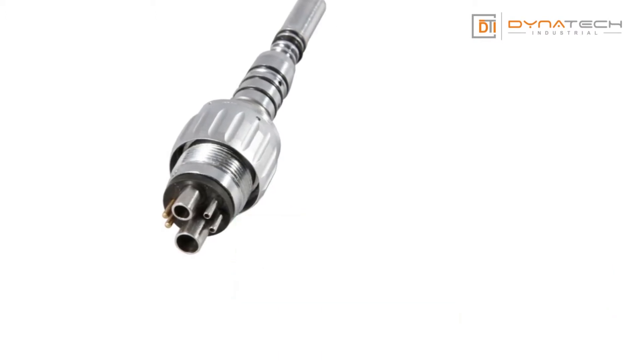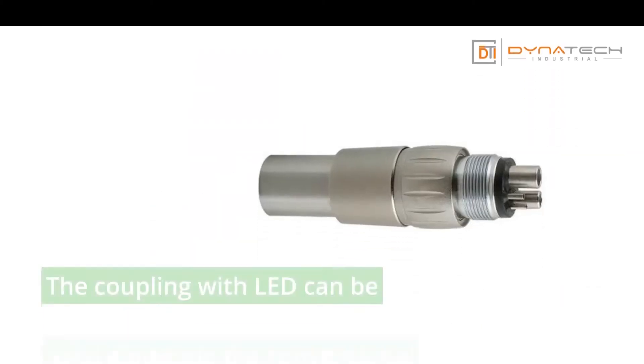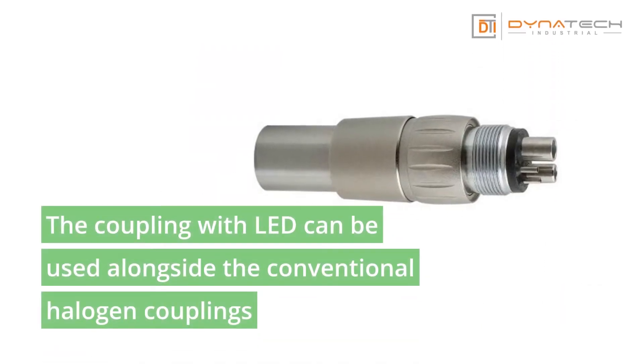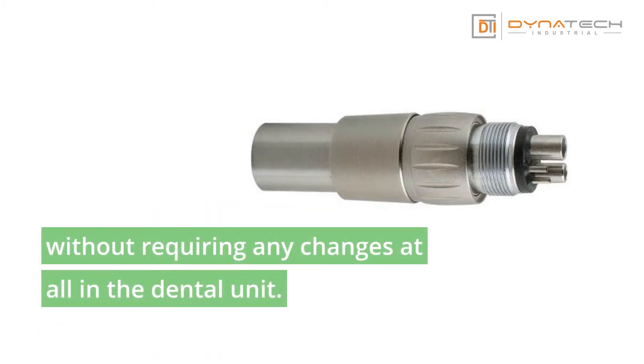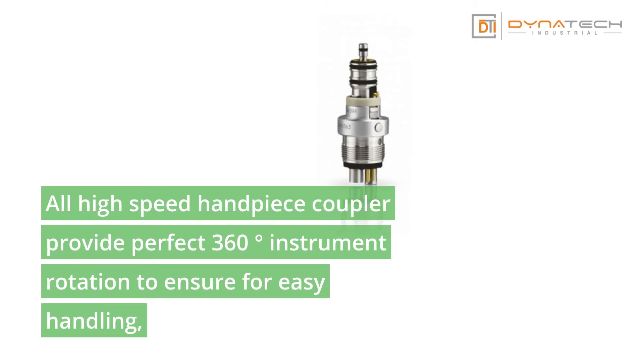The high-speed handpiece coupler features a non-retraction valve that avoids backflow of contaminated spray water to minimize the risk of infection. The coupling with LED can be used alongside conventional halogen couplings without requiring any changes at all in the dental unit.